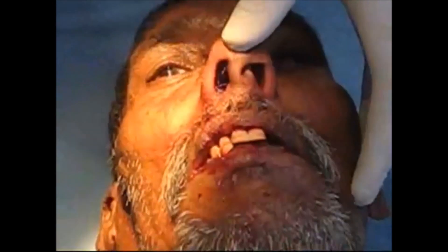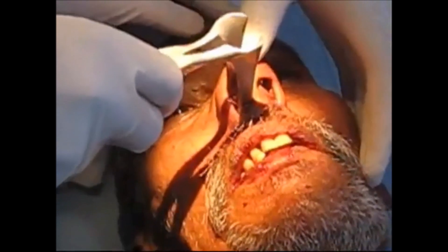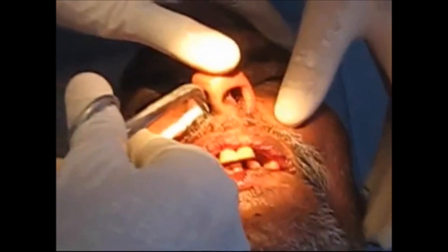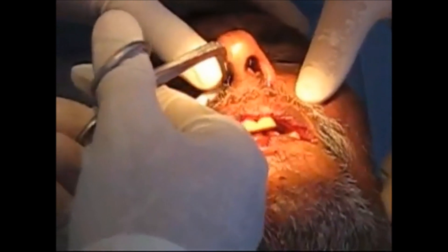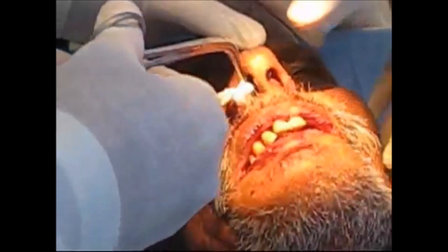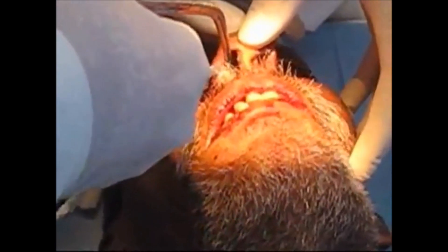Put nasal decongestant, and after that with the help of a white angle forcep we are packing it. Before that you must visualize whether there are any spurs present inside the nose, because you can damage them. So insert it properly as shown in the video.